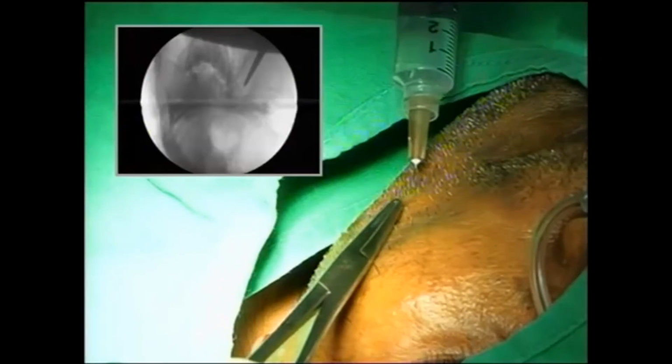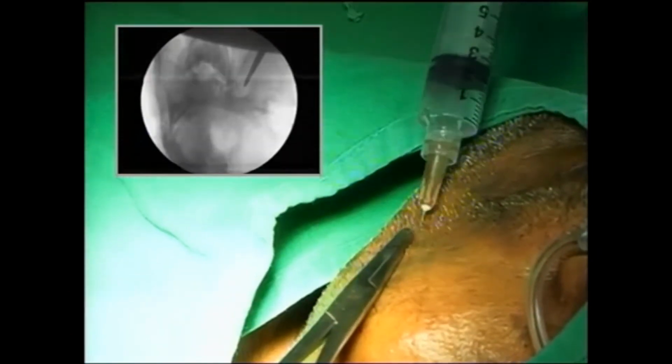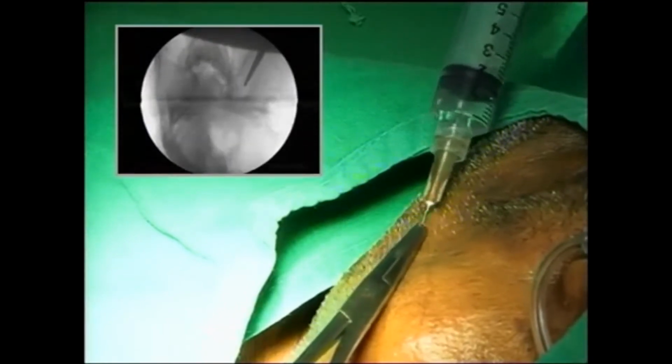It's very, very important that you keep talking to your patients when you do blocks, because they are a neurological monitor, and if something is going wrong, if the patient is not fully anesthetized, you may be able to pick it up, especially when you're doing head and neck procedures. So, and even for that matter, endoscopic spine procedures.